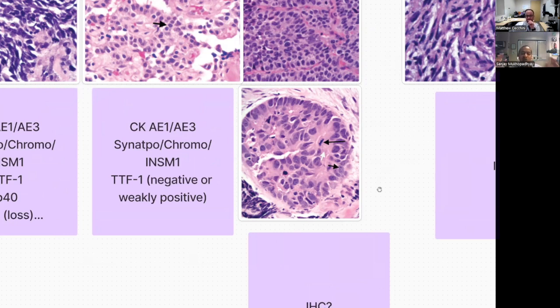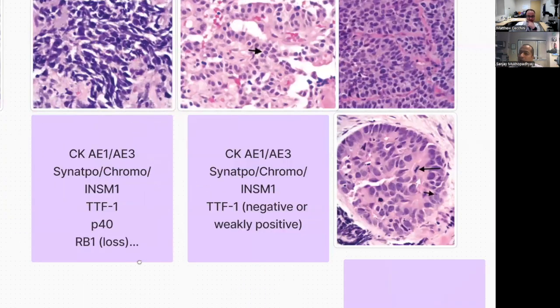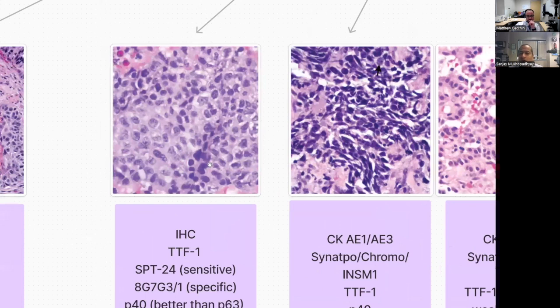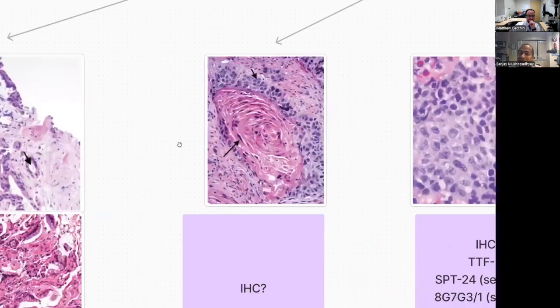I think the question to ask yourself is, will you believe the neuroendocrine markers when they are positive? So in a case like you showed, the first adenocarcinoma, I'm not going to believe it even if it's positive. So in that kind of a case, there's zero need to do it. Not the non-small cell, but the clear-cut adenocarcinoma. Definitely. Yep.